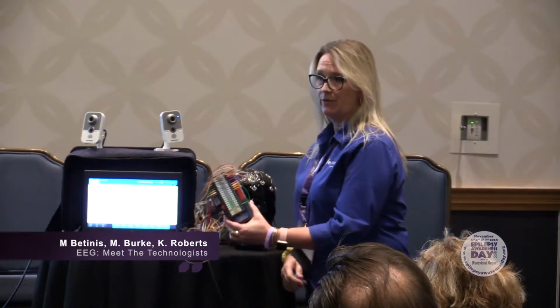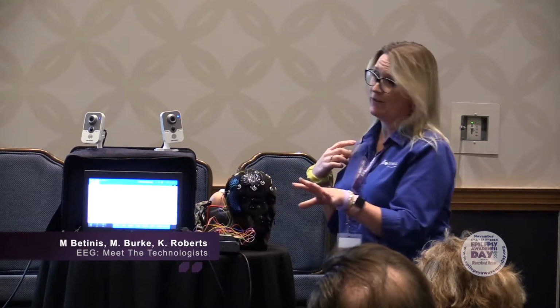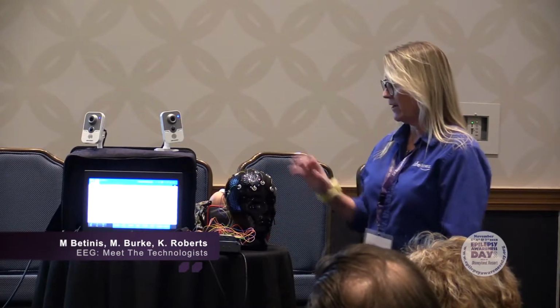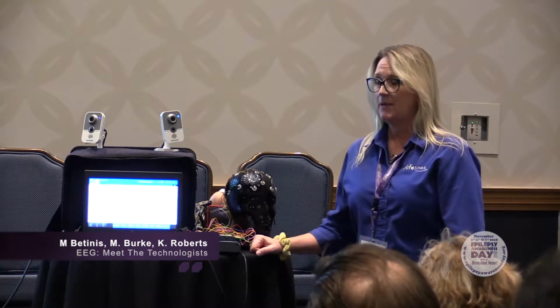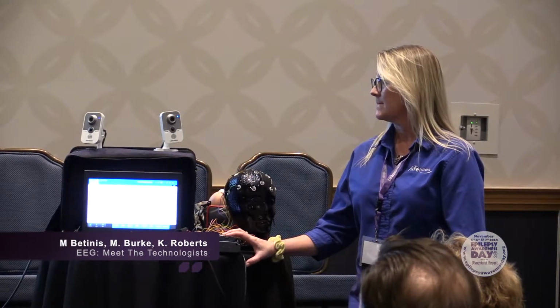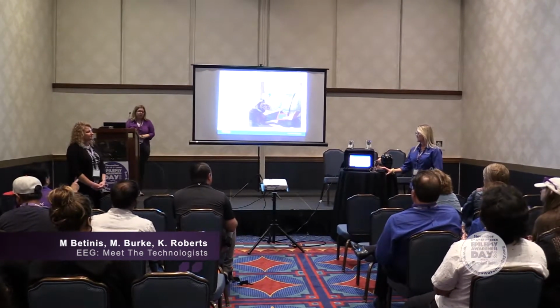Well, this is actually Bluetooth. I actually have it connected via the cable today. But it can go in a backpack, which is really good for kids because of their center of gravity. But I was just wondering if without the actual backpack portion, without all the wires, is there one? Not yet. I'm sure someday there will be. We still need a wire to go into the amplifier at this point. I'm sure at some point that will be invented. But I've heard of a company a couple of years ago that was trying to work on something like that. I think they've run into that problem of the cabling needing the amplifier. We're not there yet, but it is being looked into though.